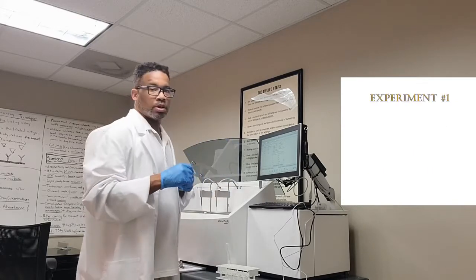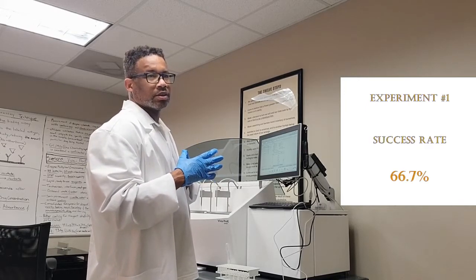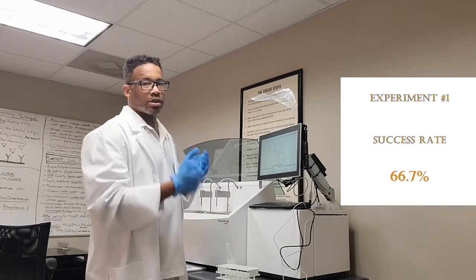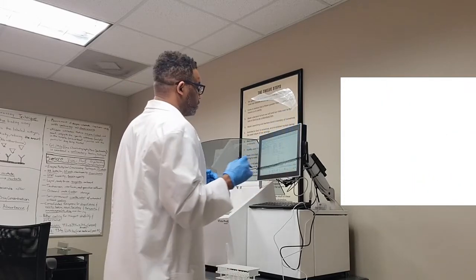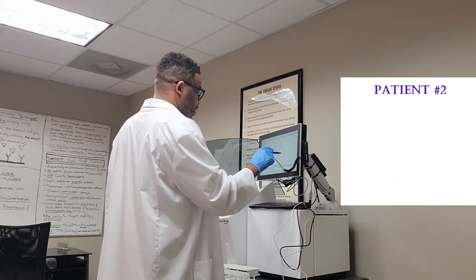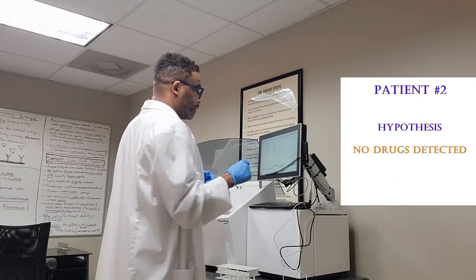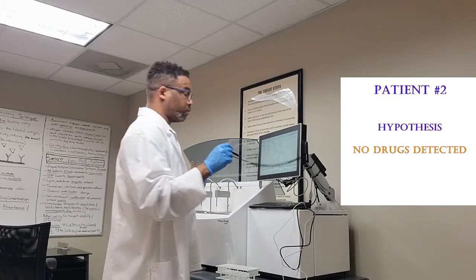So our first experiment, we have a 66.7 success rate because we messed up one of our readings. So we're gonna go to patient 2. Patient 2 was no drugs detected. That's our comment. So we suspect that nothing is in this sample.